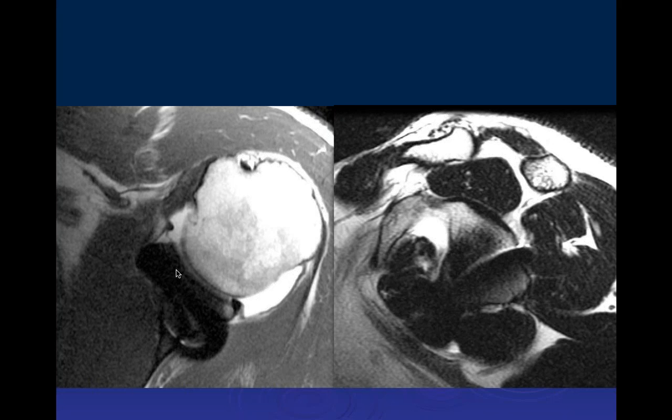The modern technique has been modified quite a bit from the old one. In the old technique that was described, all he did was split the subscapularis tendon, put the bone and the tendons in front of the glenoid, and suture the tendon. He didn't drill a hole in the glenoid neck and put a screw in there. He just put in the bone block with the tendons. So it's been modified, and I modified it myself, actually, and I used a screw that's used for acromioclavicular separations, which has wide threads in it, and that became my favorite procedure years ago.